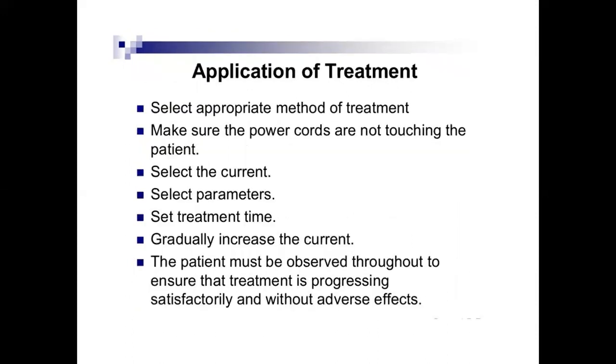The application of treatment. Select an appropriate method of treatment. Make sure the power cords are not touching the patient and not touching each other. Select the current. We select the parameters. We set the treatment time. We gradually increase the current. The patient must be observed throughout to ensure that the treatment is progressing satisfactorily and without any adverse effect.